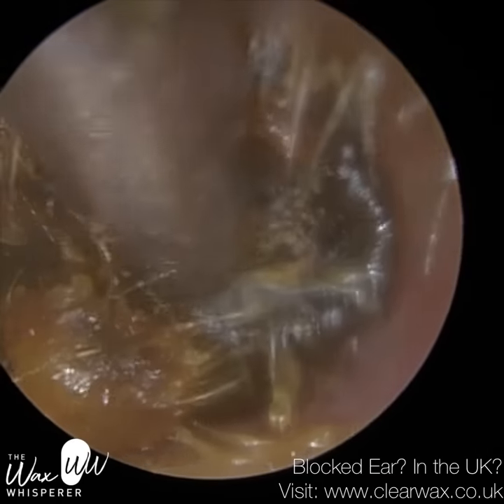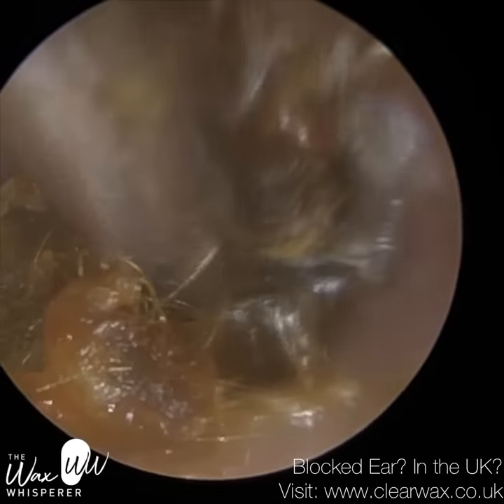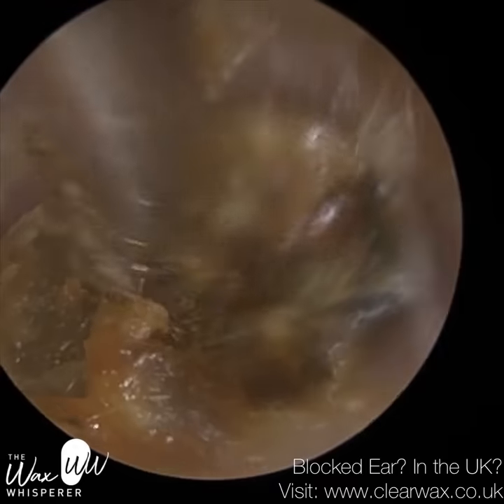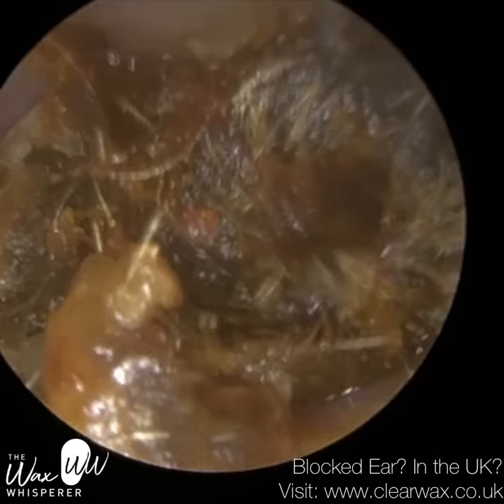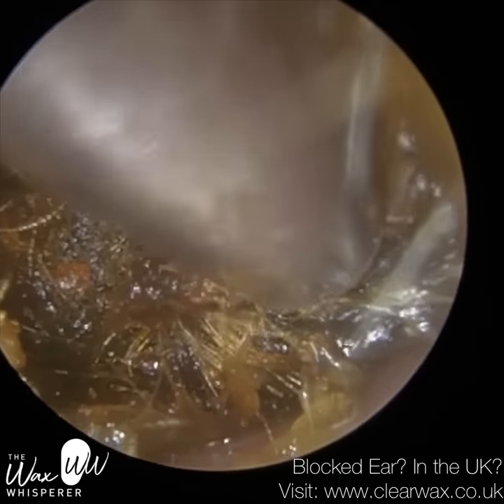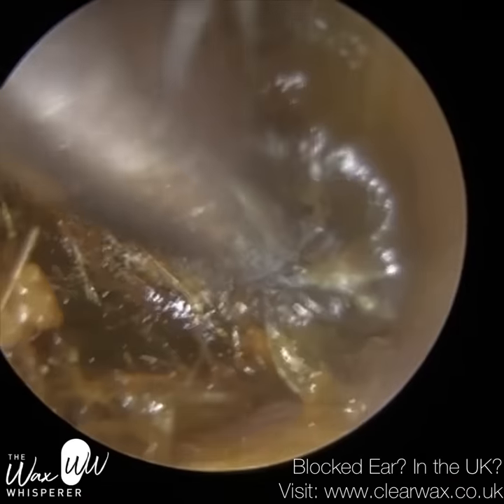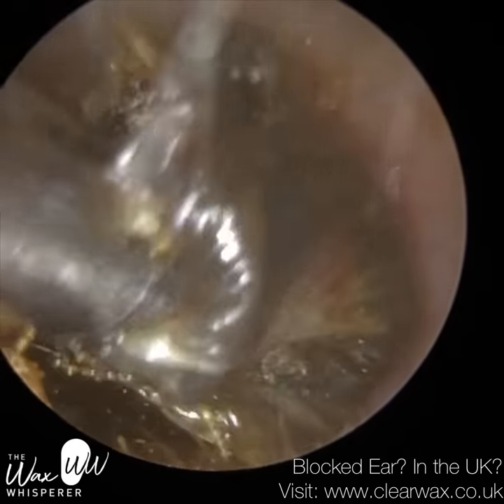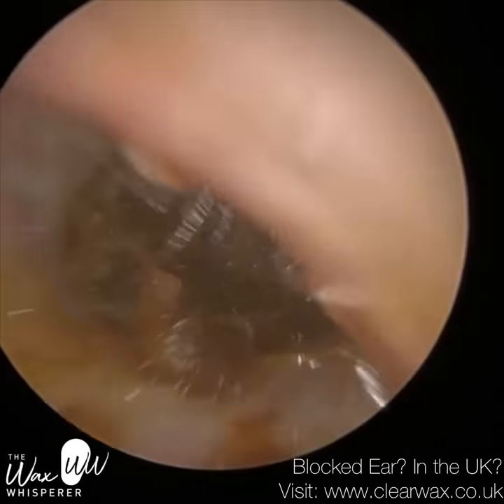Now, the patient is a lovely gentleman, and I take it as a compliment, actually, because they felt really comfortable, but they were chattering quite a lot during the procedure. In some people's ears, it doesn't affect the procedure. You just can't see the canal move. But in this case, as they were talking, when you open and close your jaw, it flexes some muscles around the jaw, and the cartilage portion of the ear canal in particular, so the outer third, it can come up and down. And it did make it sometimes a bit difficult to perform the procedure.